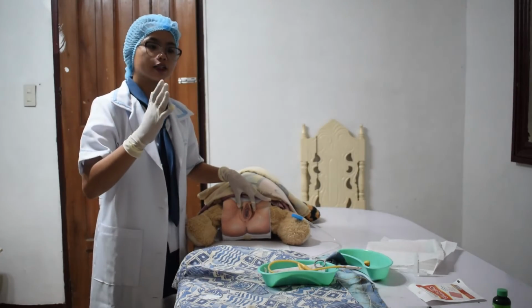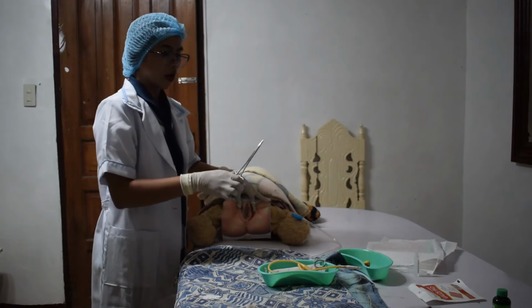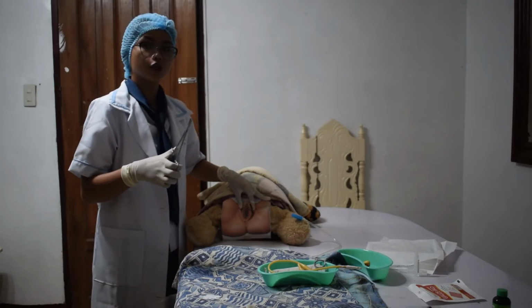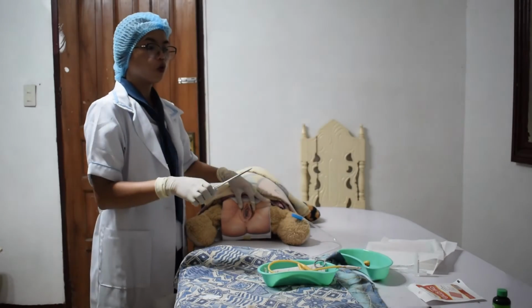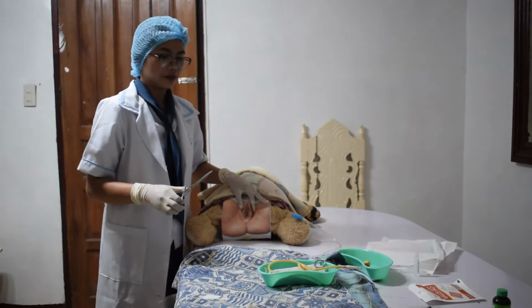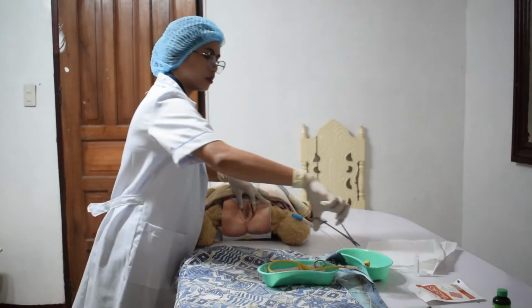With your dominant hand, using the sterile forceps, pick up a cotton ball and wipe one side of the labia majora in an anterior-posterior direction. Use a new cotton ball for the opposite side. Repeat the procedure for the labia minora.